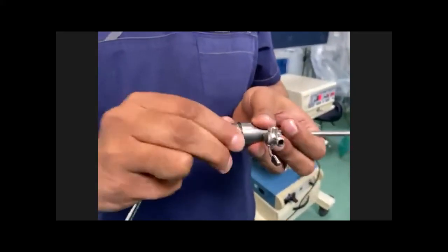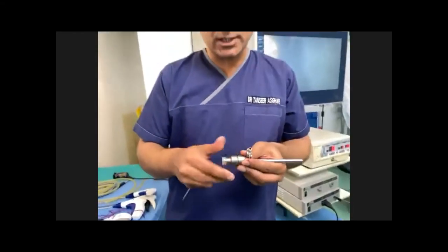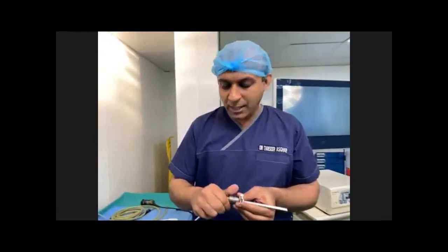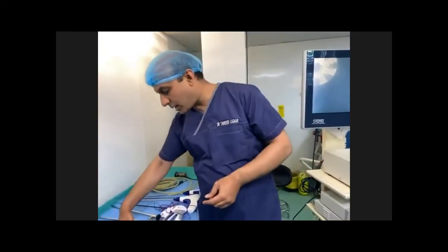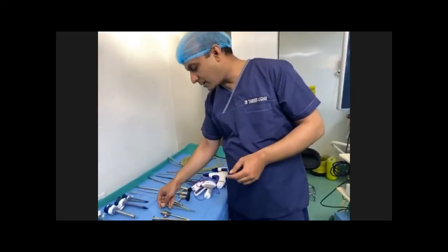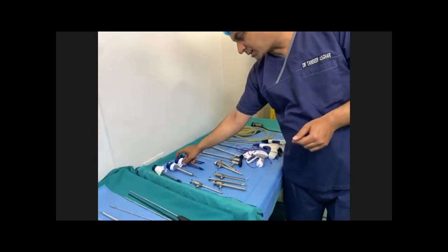There are also 3 mm trocars, and they are smaller in length, and they are usually used in pediatric surgery. The usual length of this trocar is 15 centimeters, but there are long length trocars as well, which we use in the bariatric procedures and in super obese patients and other laparoscopic procedures.